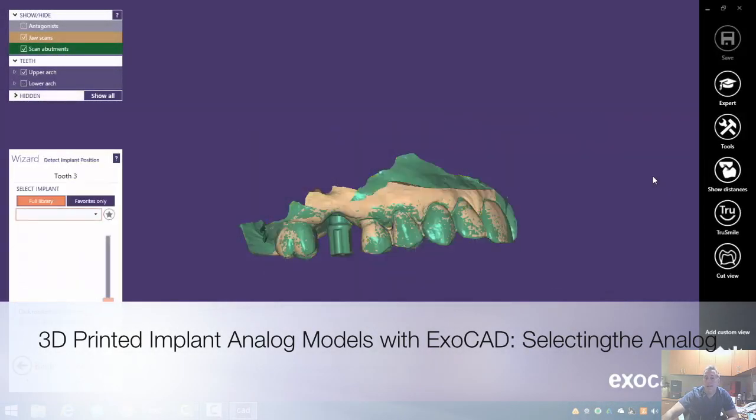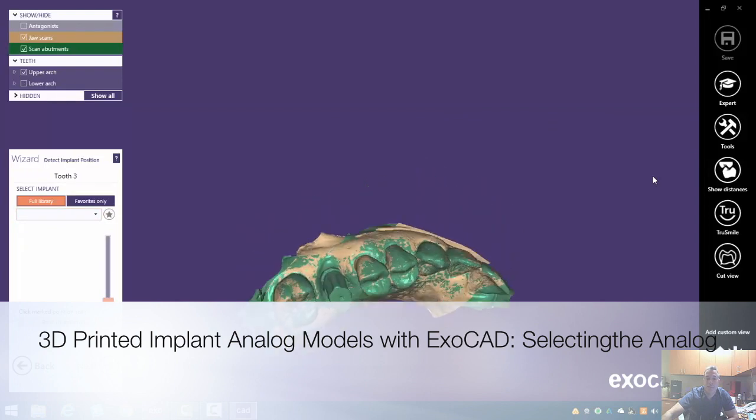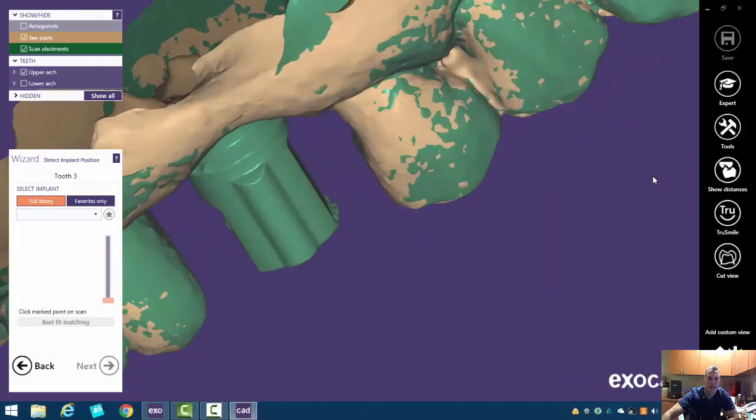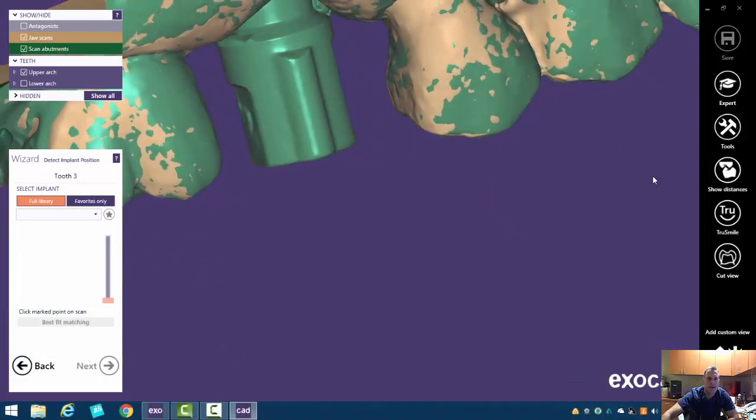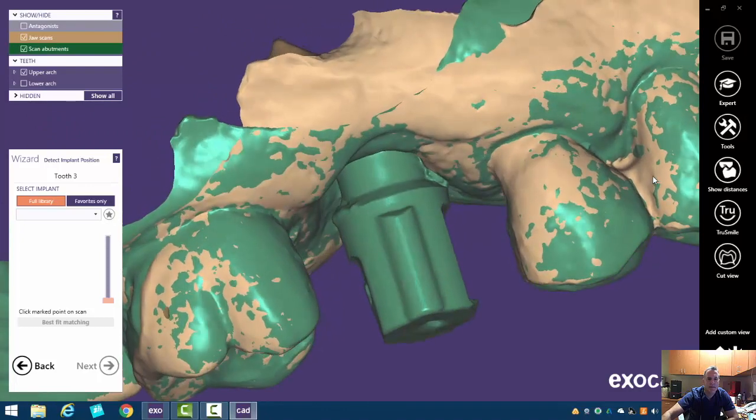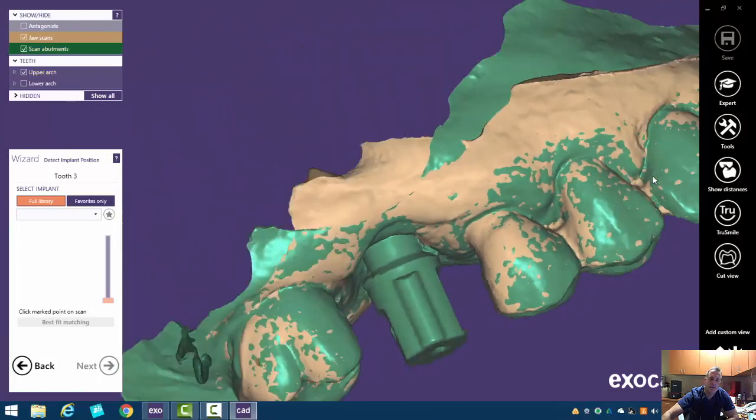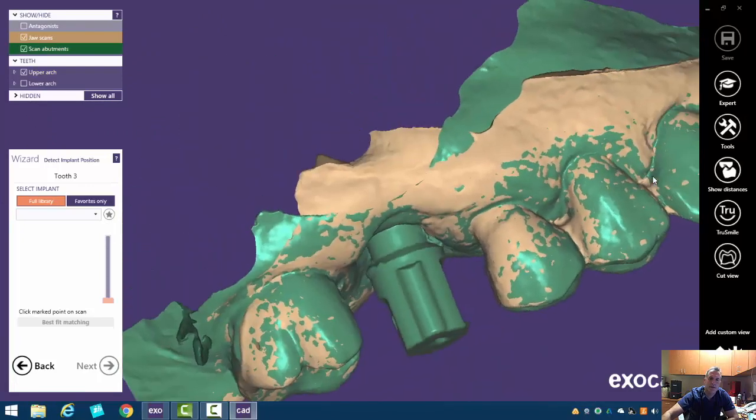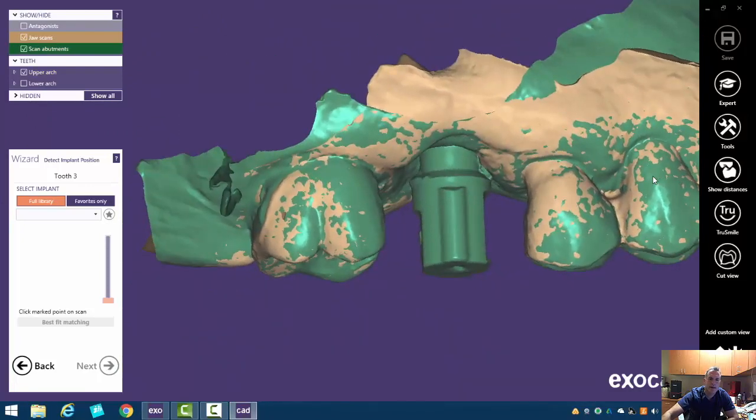Okay, next up it's going to ask us to identify the scan marker. This is from a company called NT Trading. NT Trading makes some universal scan posts for different manufacturers.